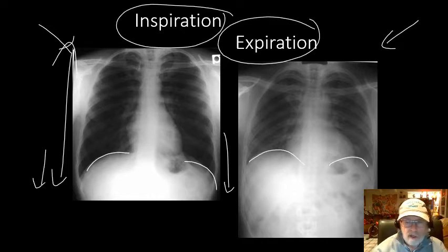Okay, the diaphragm is higher, which then, as the diaphragm moves up, instead of the heart being in a direction like this, now the heart's more in a direction like this. And therefore, it distorts the cardiac image and stuff like that.